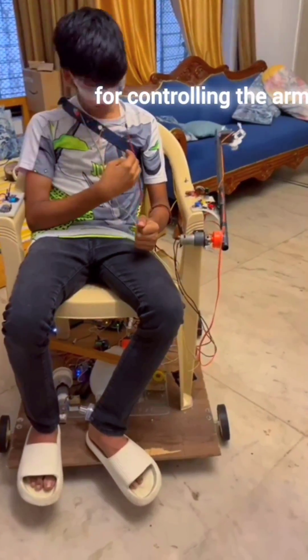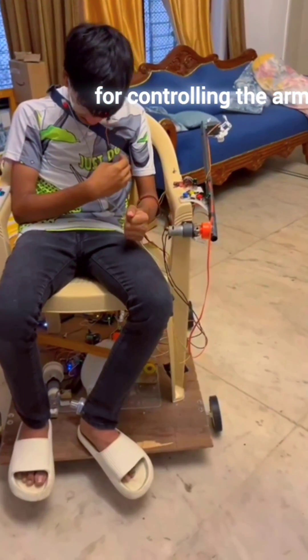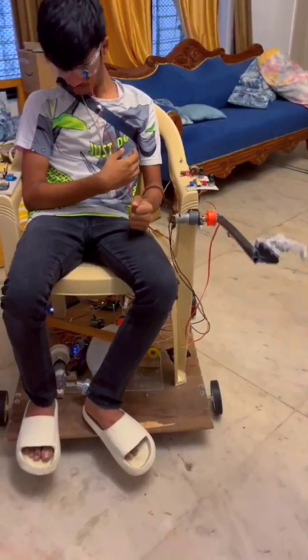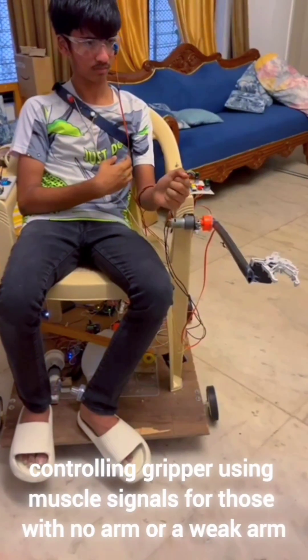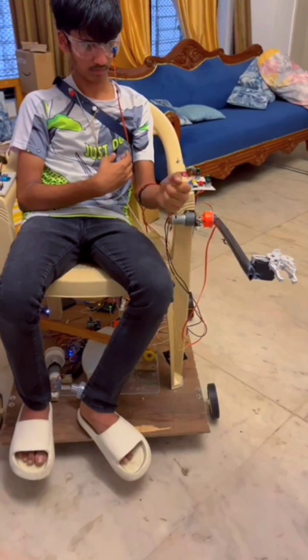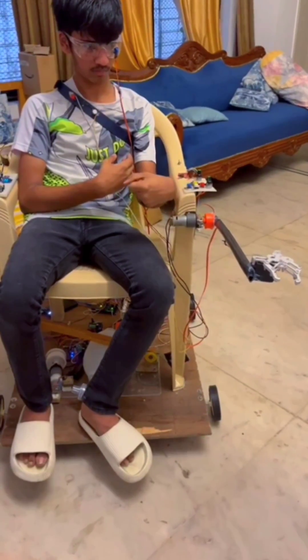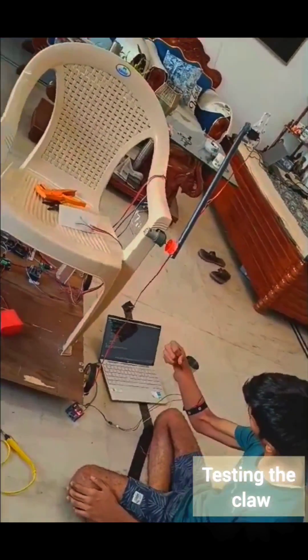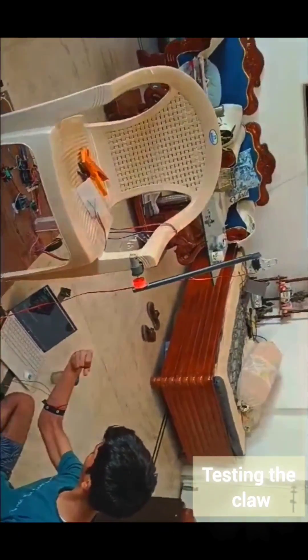For controlling the arm, there is this system for moving the arm — the shoulder joint up and down. This can also be replaced by a sensor. There is also this method of controlling the claw, the gripper, using muscle sensors. So this is controlled by the muscle sensors.